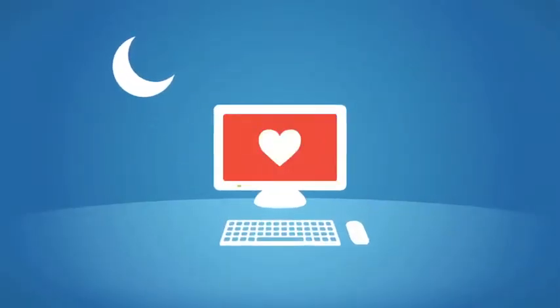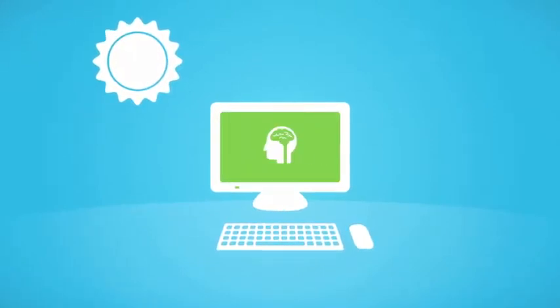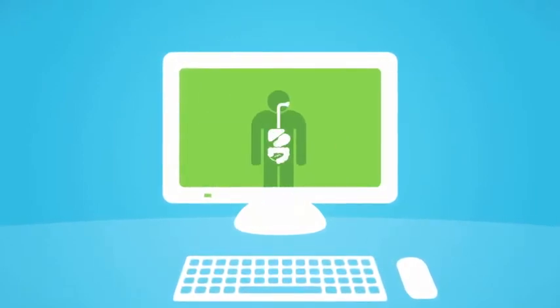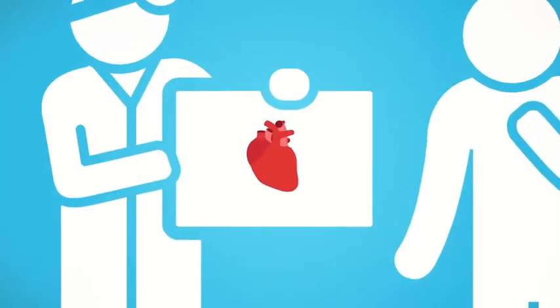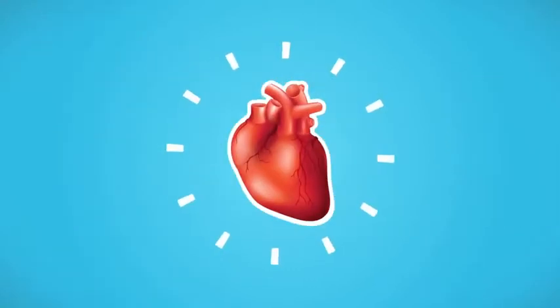Auto pre-processing continuously updates patient exams, so they're available anytime throughout the day. As new patients come in, you switch seamlessly between cases. Technologists have more prep time, and radiologists have more patient face time. View both PACS and AW images from where you are with a simple click of a mouse.